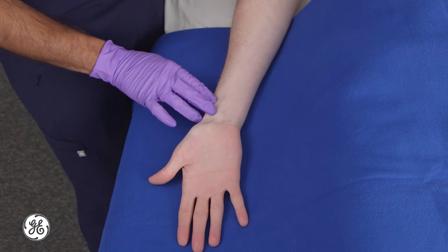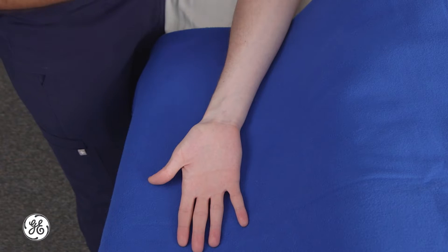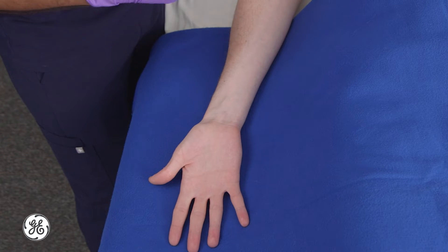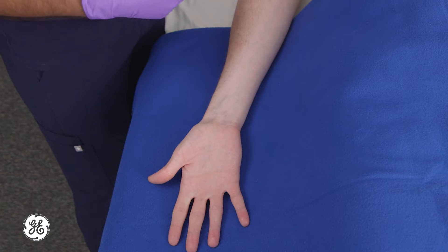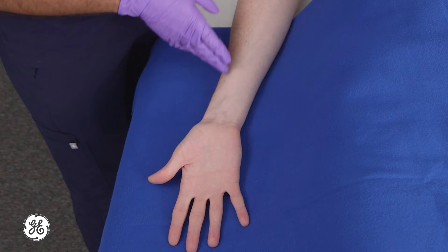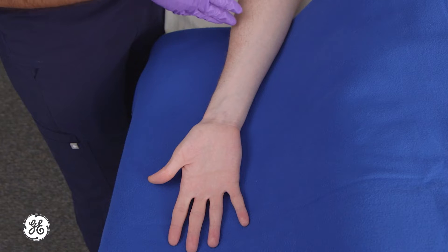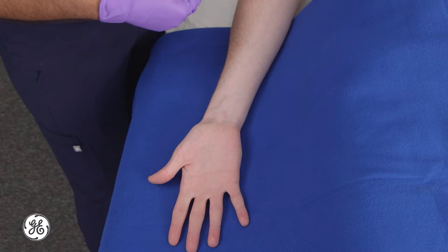Traditionally, this has been reported to be poorly effective when done in a blind approach. The reason for that is that the radial nerve branches unpredictably quite proximal to the wrist, and so a traditional approach is not very effective.